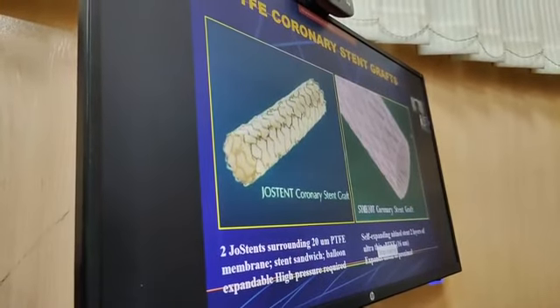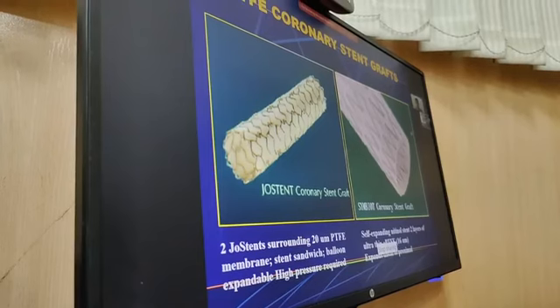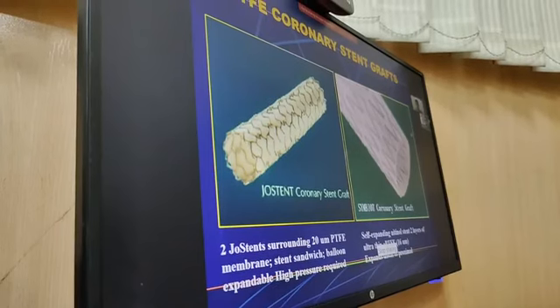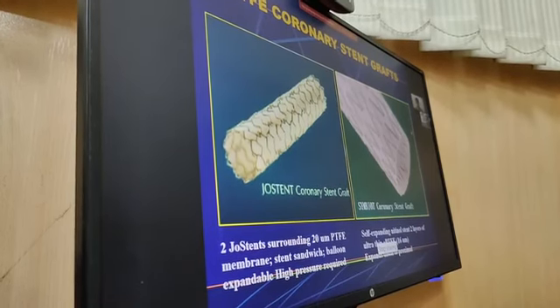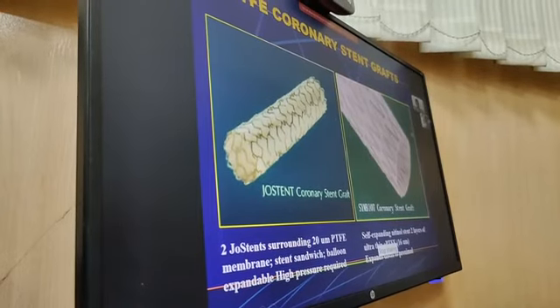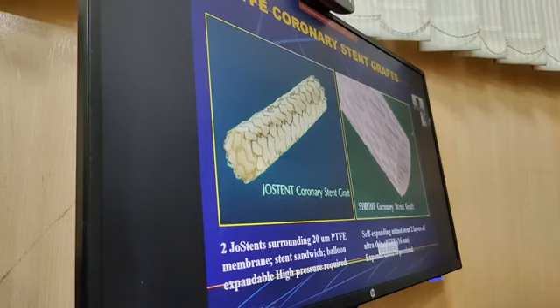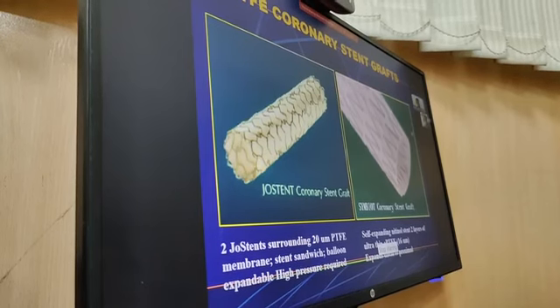raw plaque material, which is macrophages, cholesterol crystals and so on, which is the main problem, which causes a lot of distal embolization, and which cannot be tackled because thrombus will dissolve, but that is why we cannot dissolve the cholesterol. That is why they earlier used this covered stent. They thought of using the covered stent, which was also preventing some distal embolization.